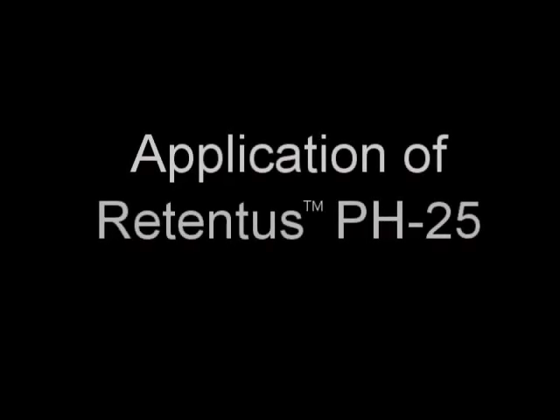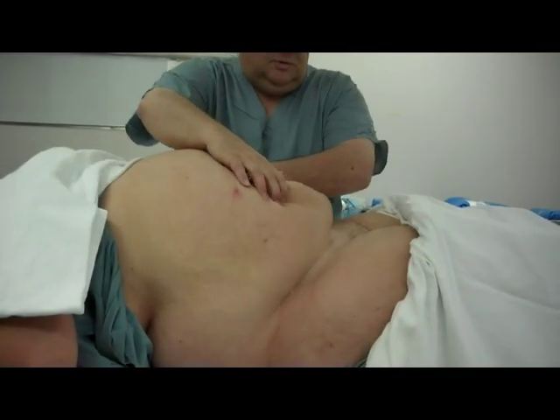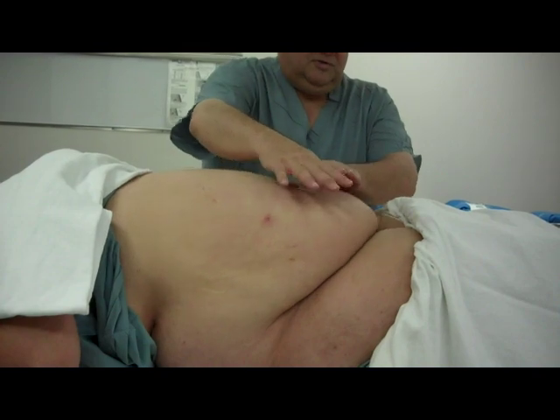Applying the Retentus PH-25. This retractor is recommended for BMIs from 30 to 50. Benefits of using the retractor are that it fully exposes the surgical site. You will achieve retraction from 90 to 130 plus degrees, and the retractor will remain secure throughout the procedure.